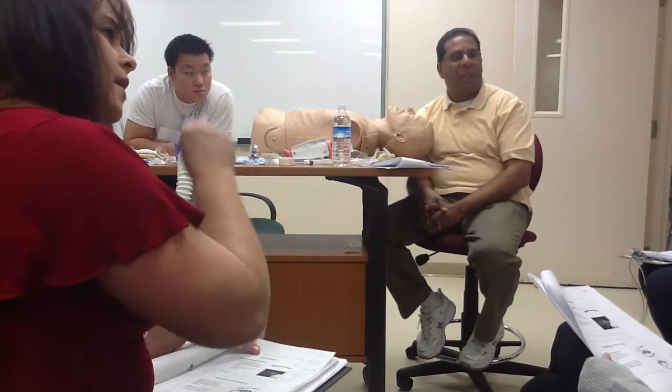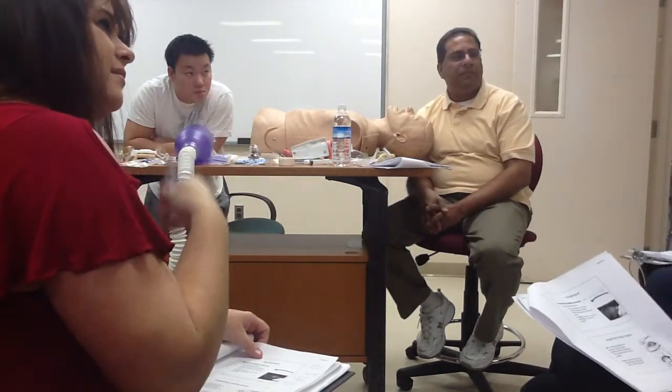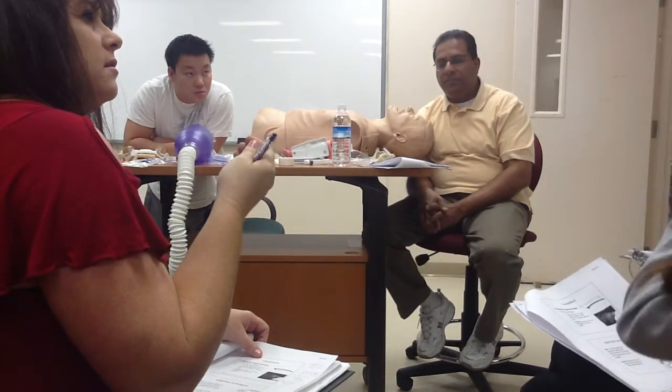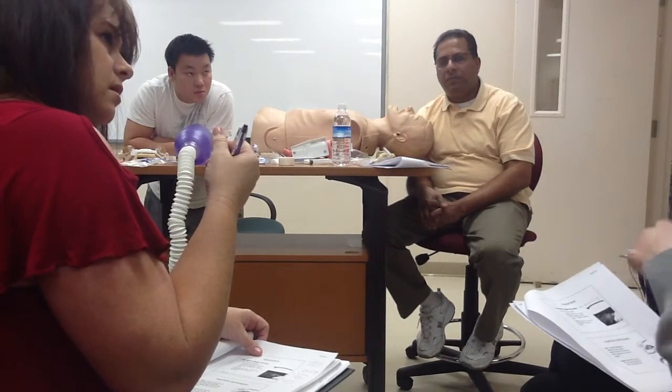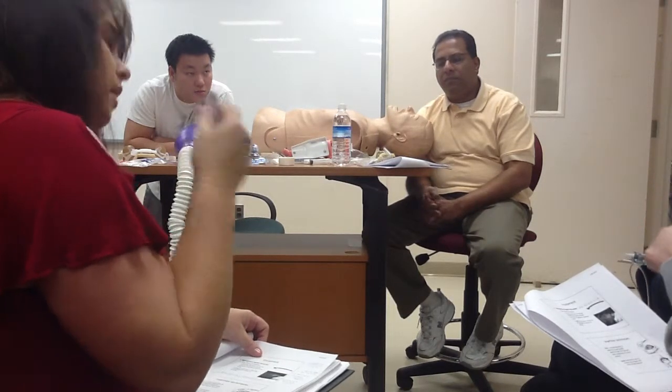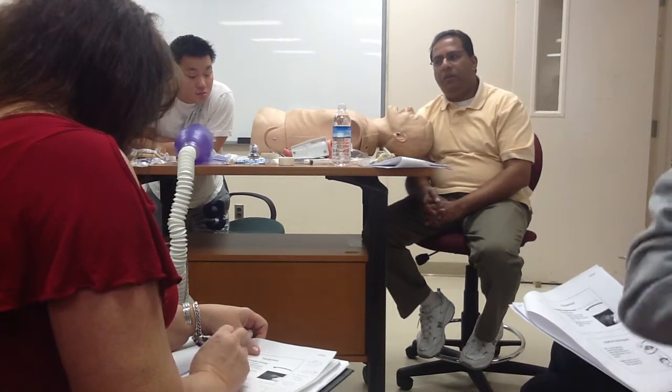Do you have to twirl the catheter on the way out? It's so hard to do. Usually it's stuck and you're trying to pull it out. Because of the airway and the catheter, that whole technique is not going to happen. That's why we replace it and just give them a clean one each day.